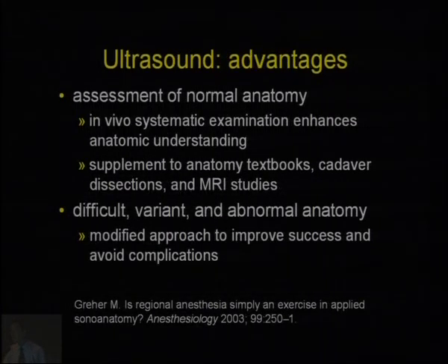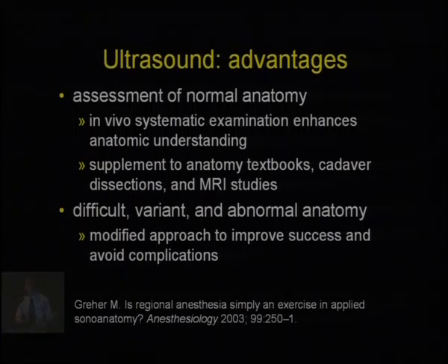So there are some theoretical advantages, and these advantages include the use of ultrasound to assess normal anatomy. So in each individual, there's no reason not to look at the anatomy anymore. So you do a scan, you will have the opportunity of doing an in vivo systematic examination that enhances anatomic understanding.